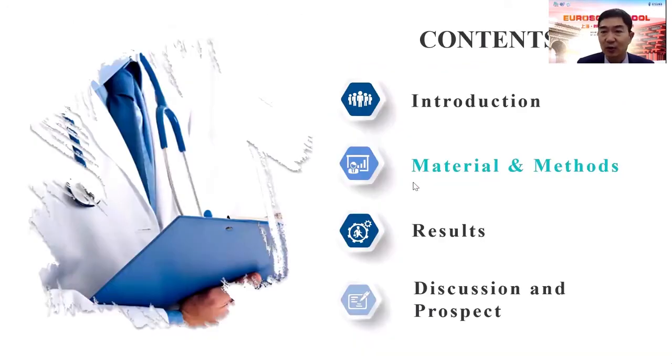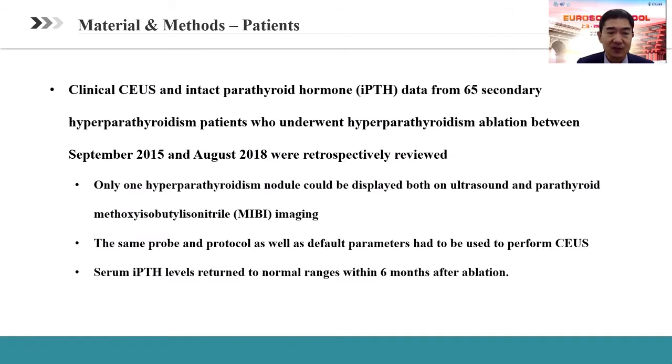Part 2 is materials and methods. The data of clinical CEUS and the value of iPTH from 65 SHPT patients who underwent microwave ablation between September 2015 and August 2018 were retrospectively reviewed.